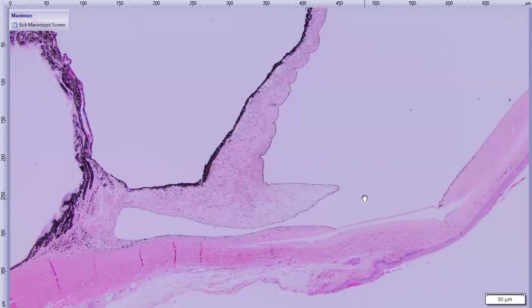And then there's no histologic uveitis. So basically, we define uveitis histologically as inflammatory cells in the uveal stroma. But it's important to note that clinically, uveitis is defined based on aqueous flare, cell flare, things like that, which may not always correlate well with whether we see inflammatory cells in the uvea or not. And that can sometimes lead to a bit of a disconnect. It's also worth noting in this case that this patient has been treated for some time for uveitis, which may also be affecting what we're seeing histologically and why we didn't really see a histologic uveitis. So I think that's all to discuss.